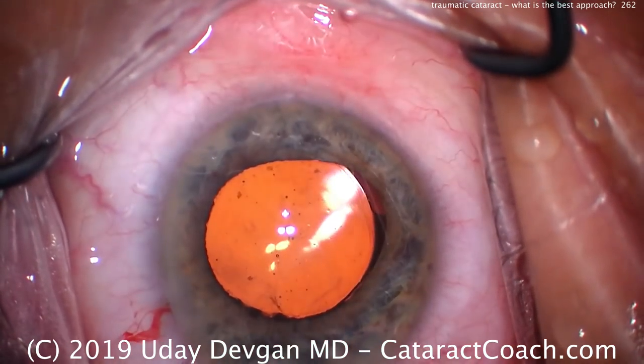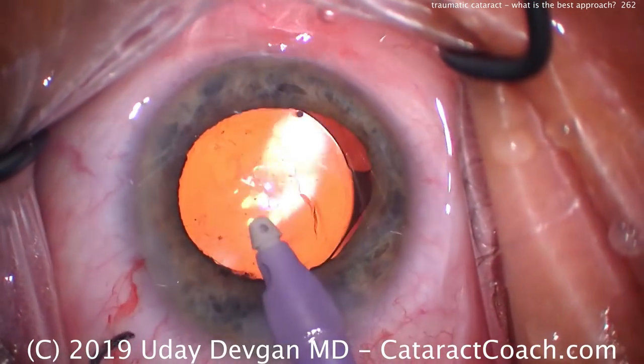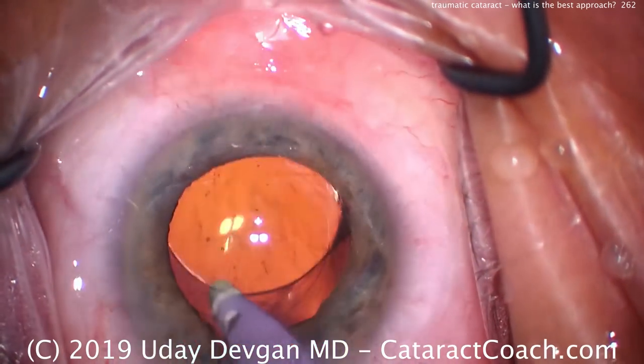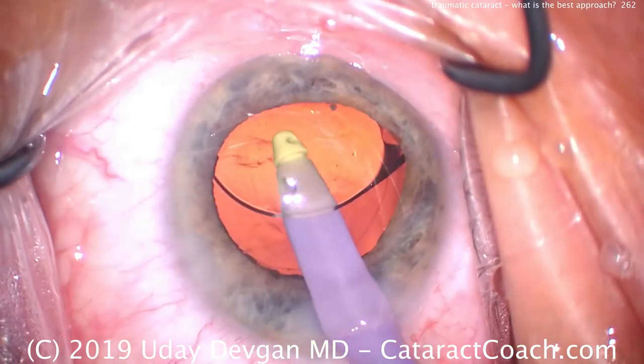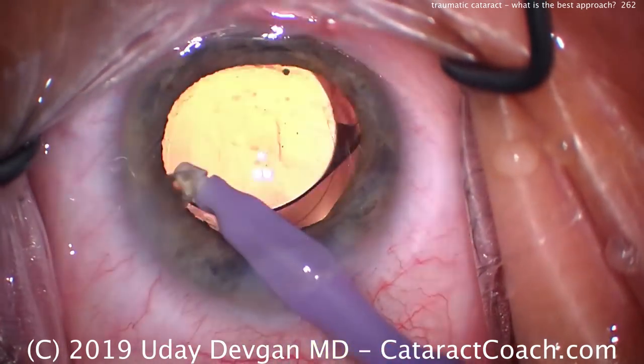There's the lens. Looks beautiful in the capsular bag. Notice how he did, just in case, put the haptic in the area of the traumatic cataract. And that's just in case there is any future zonular weakness there. That haptic will act as a strut. But I think this patient's going to do great, and I don't think there'll be any future issues.